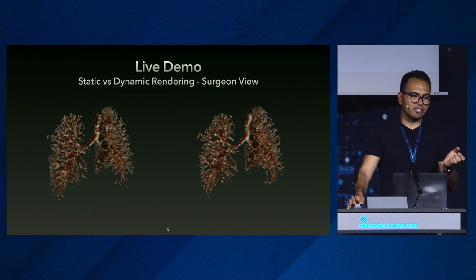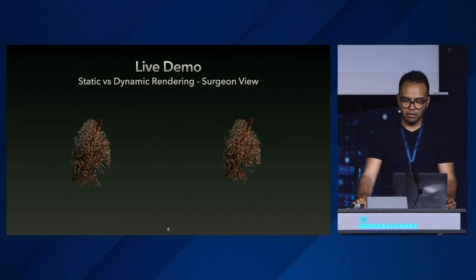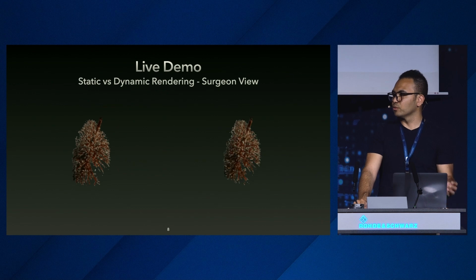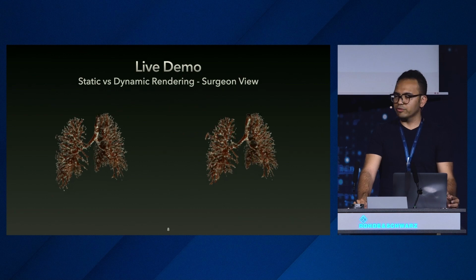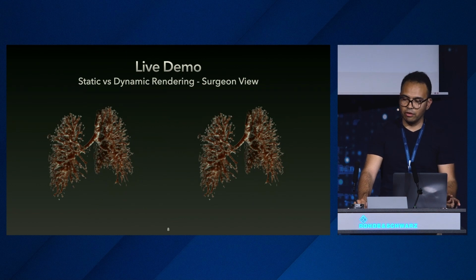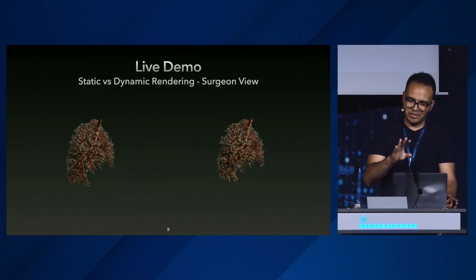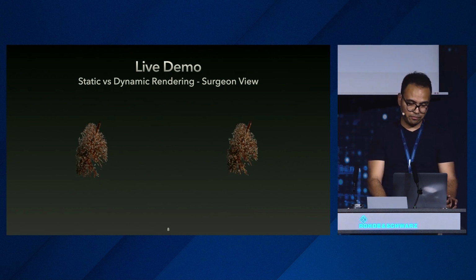If the surgeon is moving his tool all around, outside or inside of the organ, we're usually trying to track these tools, right? So why not present it in the 3D model? I'm really sure some companies are offering something similar to that. But what we're trying to push forward here is the neural rendering capability, which will bring an enhanced view, first of all, but also explainability for the operating team. It's not that the doctors are not good at doing it, but they can be helped by having this 3D view all along.